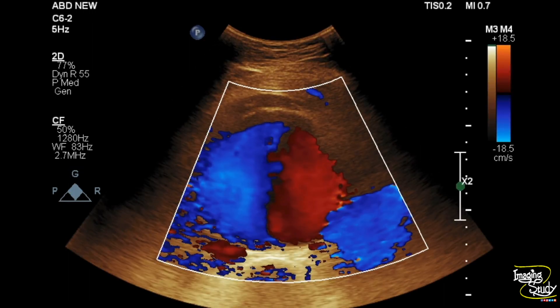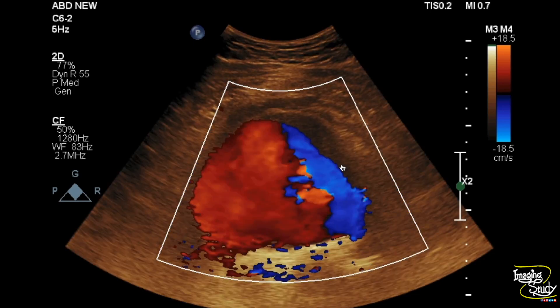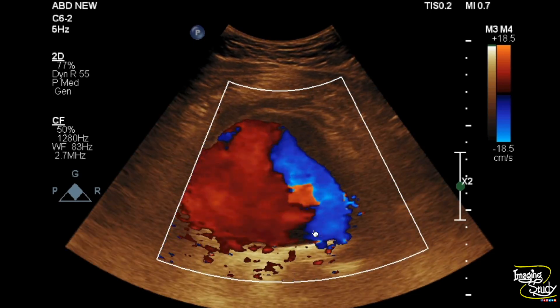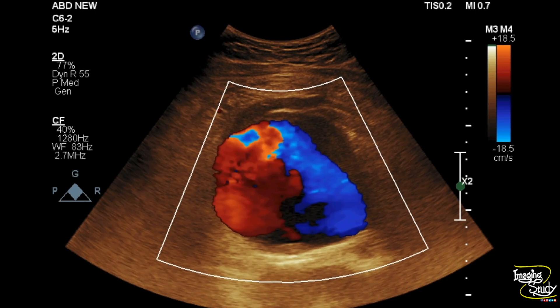Now when we put the color Doppler, you can see the typical yin-yang pattern or Pepsi sign, indicative of a to-and-fro flow pattern.